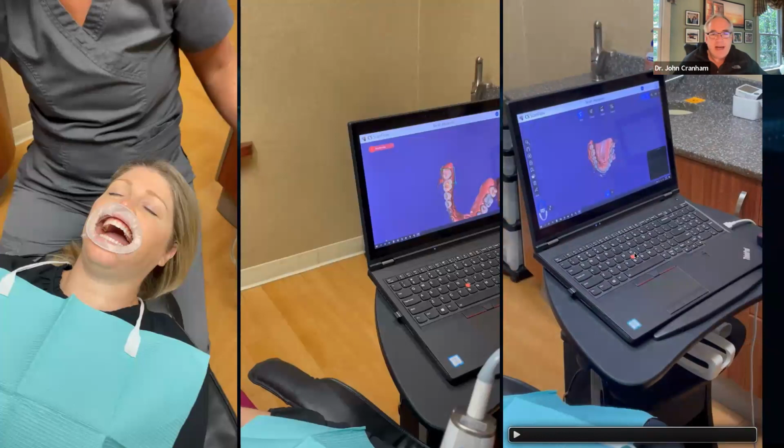And if we send to a lab, understand what the lab has is software to be able to take the scan, the mesh, whatever you want to call it, and then do things to it, whatever we prescribe, whether that's making a crown or a bite splint, or maybe they're going to do a wax up. And what we should be thinking about as practitioners is that the software is still available to us as well.